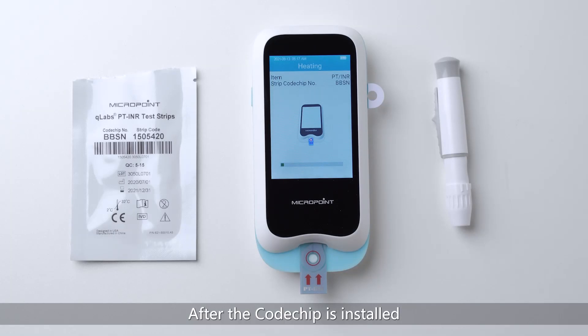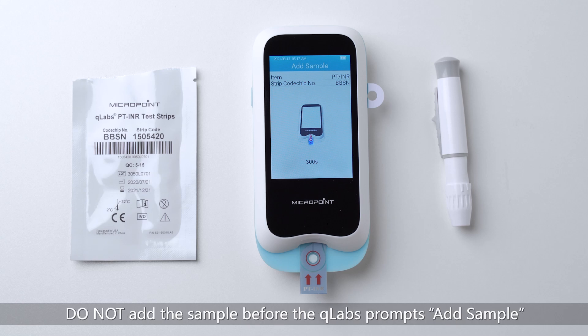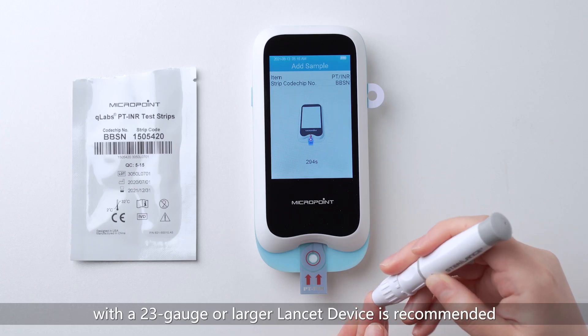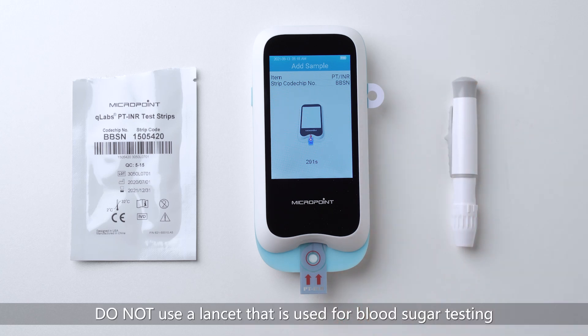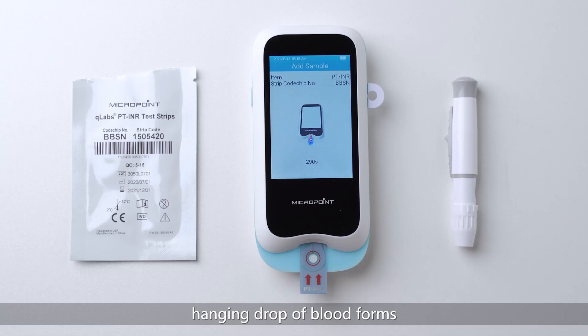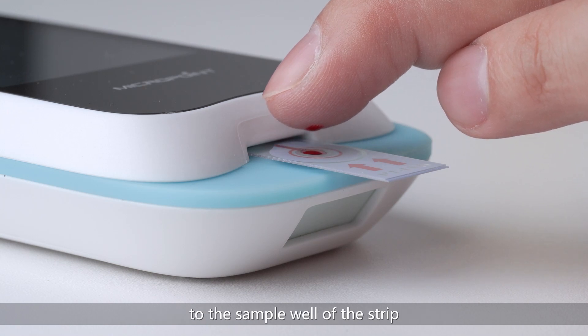After the code chip is installed, the Q-Labs will go to the heating state and display the heating progress. After the completion of the heating step, the sample must be added within 300 seconds. If this time window is missed, the system will deliver an error message indicating sample addition time is out. Wait until the heating progress turns to Add Sample — do not add the sample before the Q-Labs prompts Add Sample. Puncture the finger with a 23 gauge or larger lancet device. Do not use a lancet that is used for blood sugar testing. Apply gentle continuous pressure until a large hanging drop of blood forms, then add one large hanging drop of blood to the sample well of the strip.